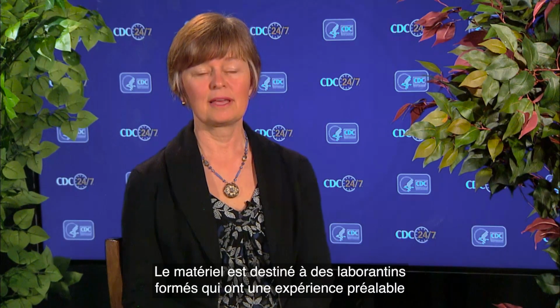My name is Jane Basile, and I am a microbiologist with the Centers for Disease Control and Prevention at the Division of Vector-Borne Diseases in Fort Collins, Colorado. This video is intended as an aid to diagnostic testing of patients suspected to have Zika virus infection. The material is aimed towards trained laboratorians who have previous experience with viral diagnosis.